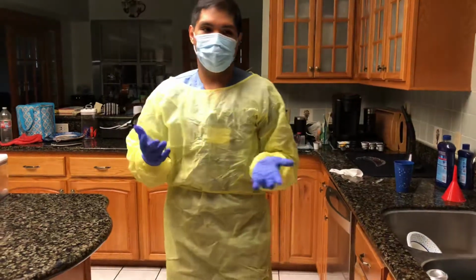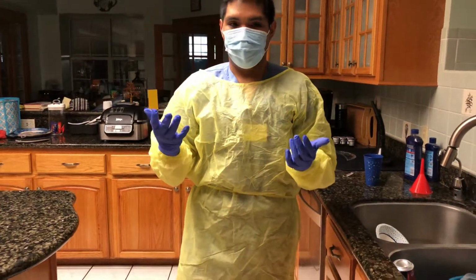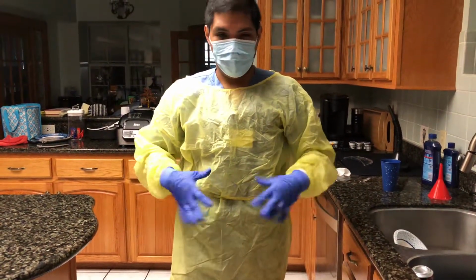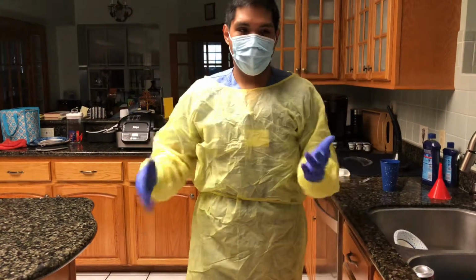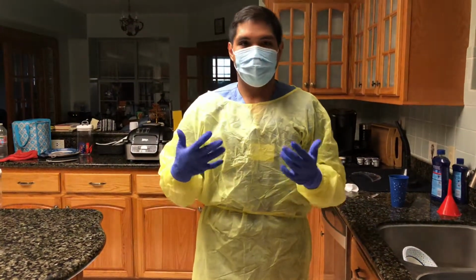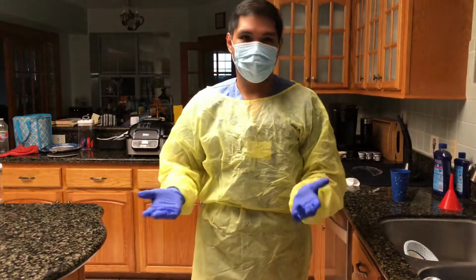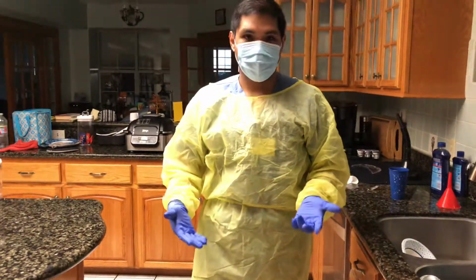Okay, now I'm going to teach you guys how to take it off, or doff PPE. The first thing we need to do, if your tie is on the front, then you untie it first, but don't remove the gown. Since mine is in the back, I'm gonna take off the gloves first. We have to treat this whole front area, the outside, as contaminated. You just did your procedure, you might have some body fluids and stuff like that. Even if you don't see any, you have to treat it as if it's contaminated.